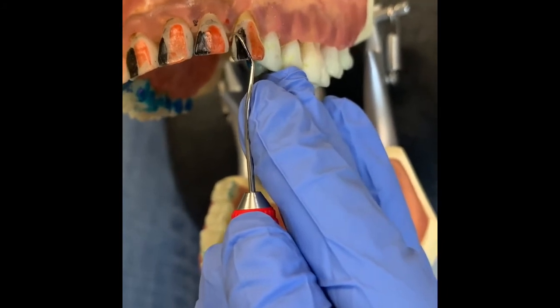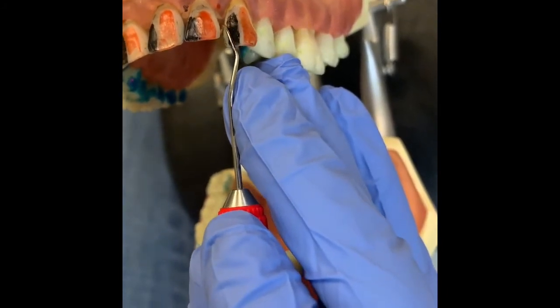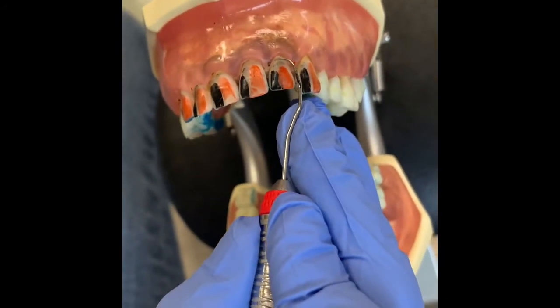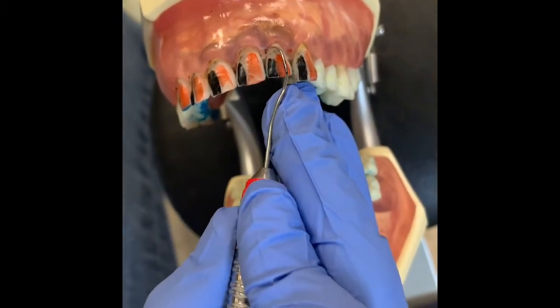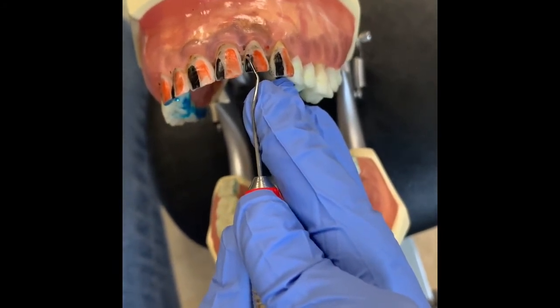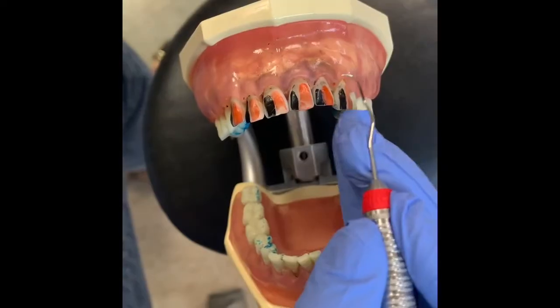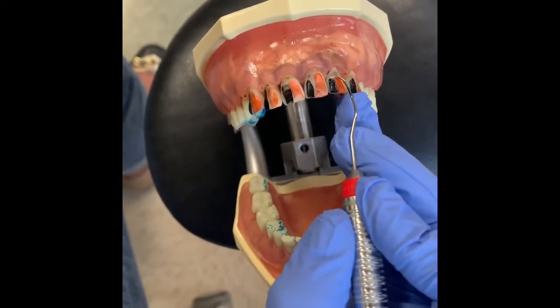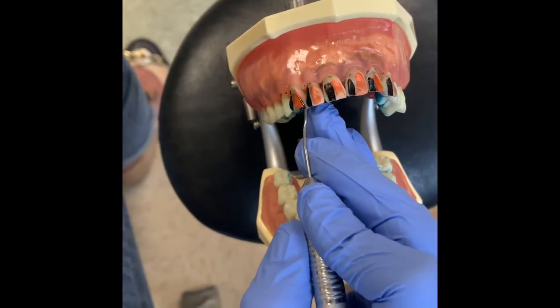Come up till you hit the contact, and then you'll come out, okay? Then you'll go all surfaces towards you now. So now you'll start number 10. Surfaces towards until you hit the contact. Now I've done all surfaces towards. So I do number 11, 10, 9, 8, 7, 6 surfaces towards me.